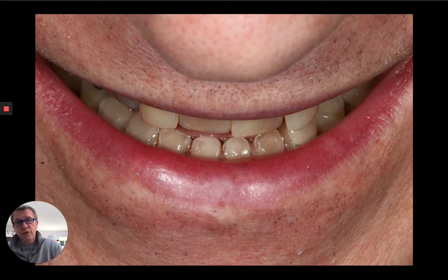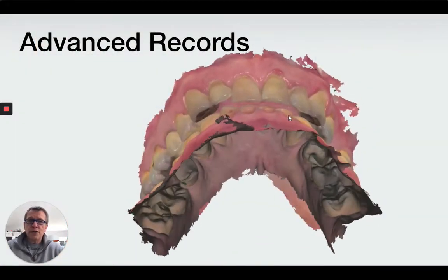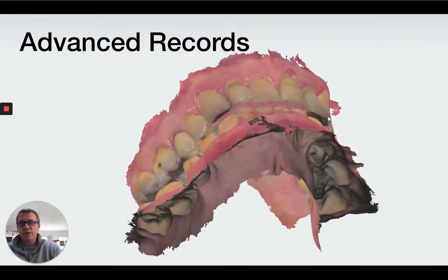And then also, that can also help a little bit with airway as well, as we look at these cases where we're doing a little bit more expansion, if you like. So this is not a big case for expansion, of course. So we're going to do some advanced records.